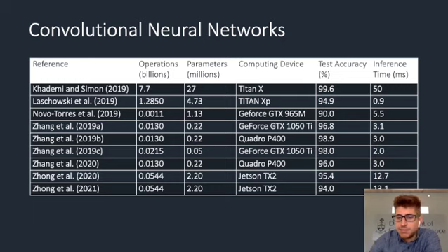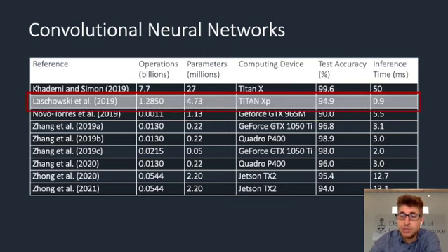Now, since then, a number of research labs have likewise used convolutional neural networks for image classification of walking environments. However, each of these deep learning models, including our original system, were each trained and tested on different computer vision datasets, which makes direct comparisons between these different systems quite challenging.